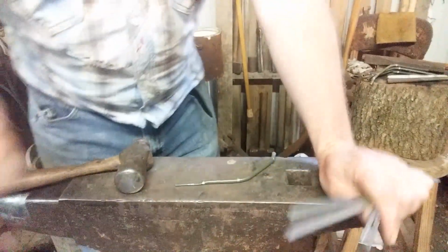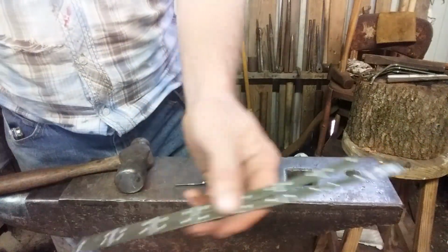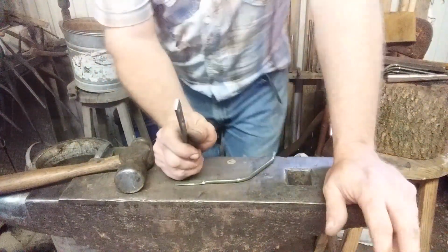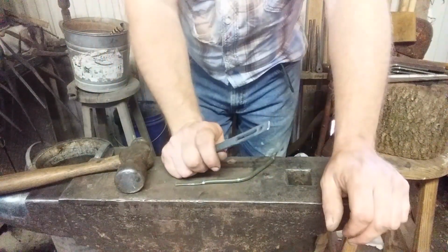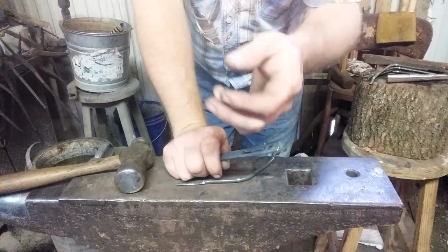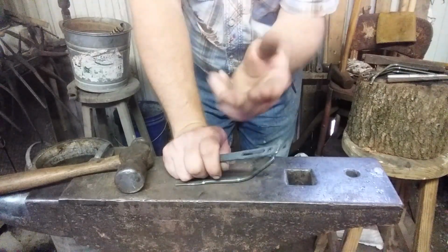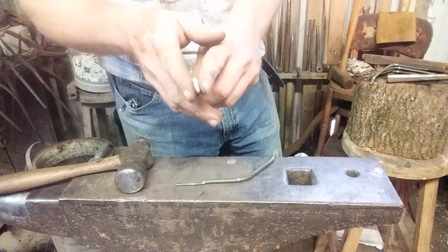Alright, well, I've made a lot of extra lengths, and I'm going to drill these out before I cut them off. And it's good rigid stuff and nice and thin, but keeping in mind that you can't have a digit moving on center because this is the center fulcrum of everything. I went ahead and decided to balance it out and put 4 fingers on top and a thumb on the bottom, but the thumb can't be on one side or the other, so the thumb has to be 2 pieces working as one, with enough gap to be able to clear this center line.